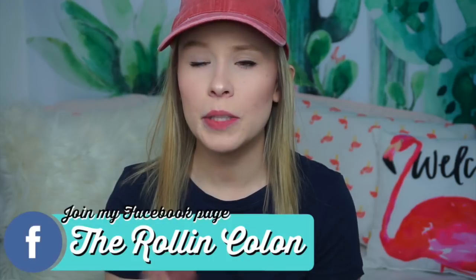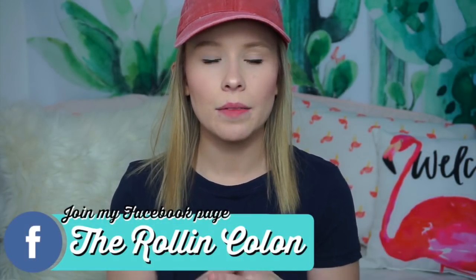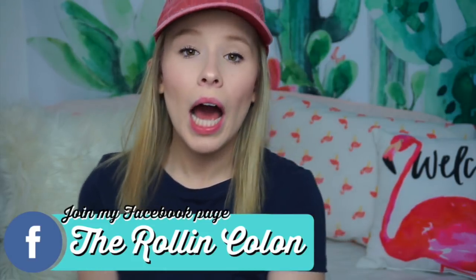I have traveled once with an ostomy. It was an interesting experience, but I just thought I would share my journey with that. So what I personally chose to do is carry all of my ostomy supplies with me. I didn't want to put them in my checked luggage because those things get lost all the time, and I would be screwed if I had gone and didn't have my ostomy supplies if my luggage somehow got lost.